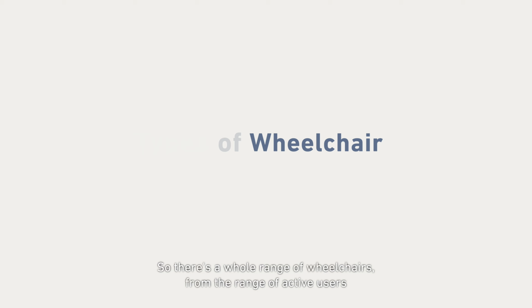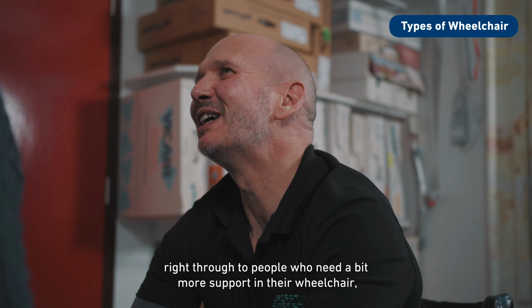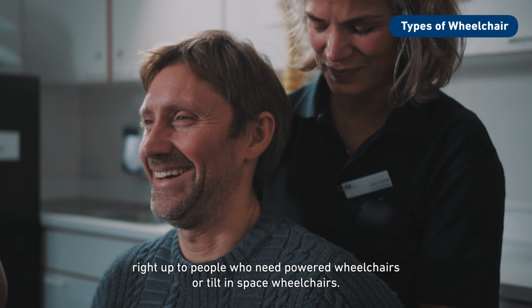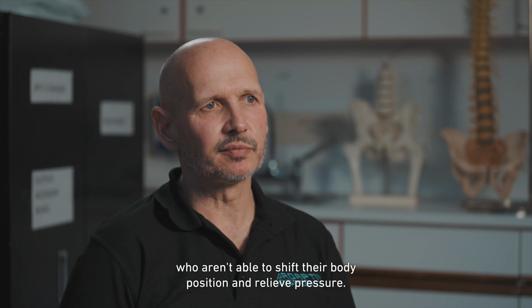There's a whole range of wheelchairs, from the range of active users to enable 100% independence, right through to people who need a bit more support in their wheelchair, right up to people who need powered wheelchairs or tilt-in-space wheelchairs, who aren't able to shift their body position and relieve pressure.